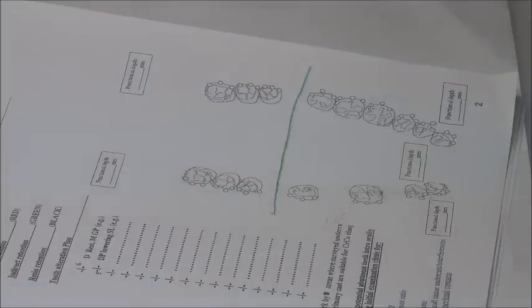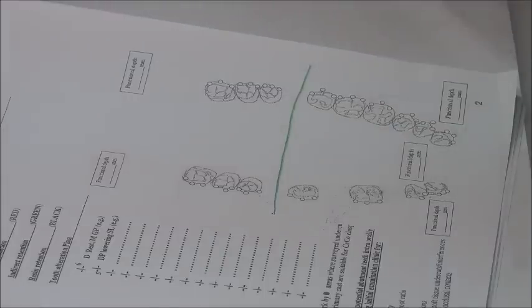What else do I get from cross arch stabilization? From its name, stability. I have more stability components. What are my stability components on the other side? What is providing stability against lateral forces? A major connector partially. Usually stabilization, you get it from vertical components. What are the vertical components? Rest? No. I mean, it contributes, the rest contributes. Actually, if I say no, it's wrong. But it's partial. I want major stabilization components. Guide plate? There's no guide plate because I have no saddles.